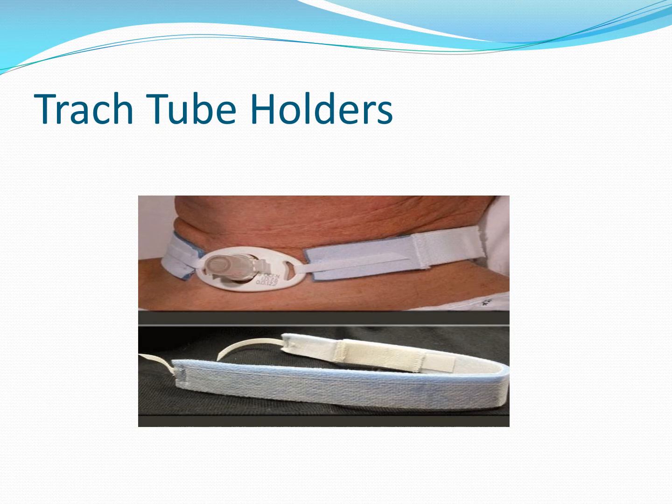At that point, we can put on one of these trach tube holders and start using drain sponges the way they're designed to be used, and that is behind the flange. You may have a sacrificial one you put on top of the flange, but there really needs to be one beneath it to capture as many of those secretions as possible and to help minimize the chance for infection.